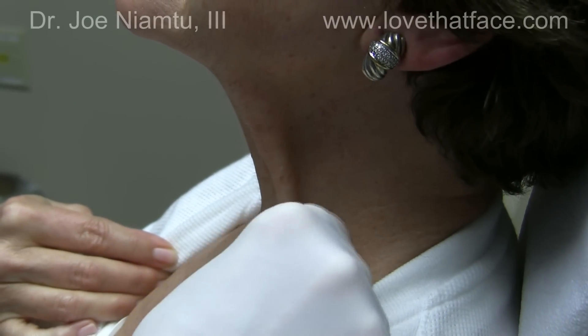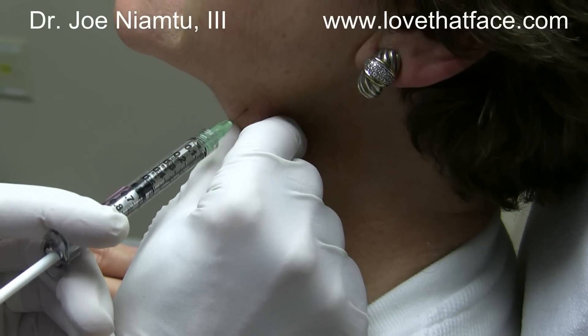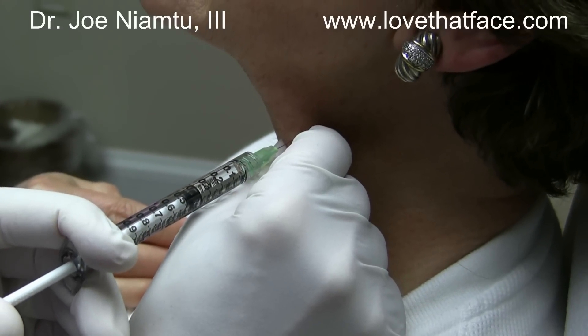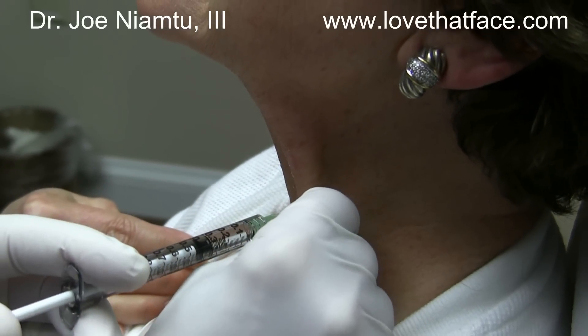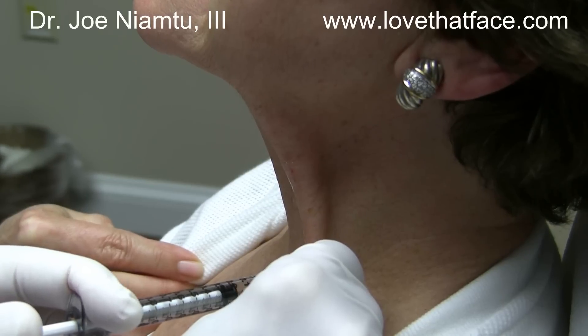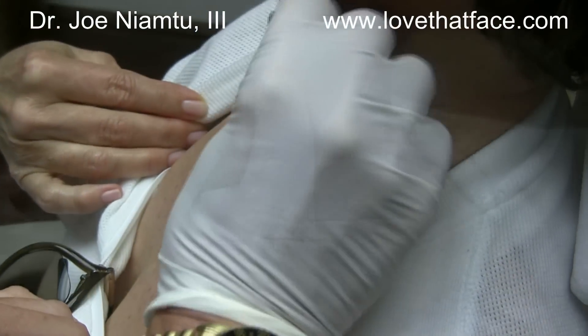We're going to inject a little bit of Botox in the platysmal bands here. This is something you have to be experienced with and very careful about, because you don't want this to get on other muscles in the front of the neck. We're usually pretty conservative with this in our injection.